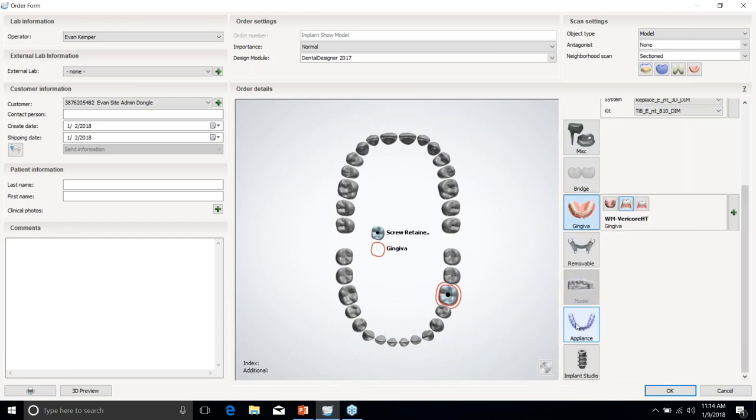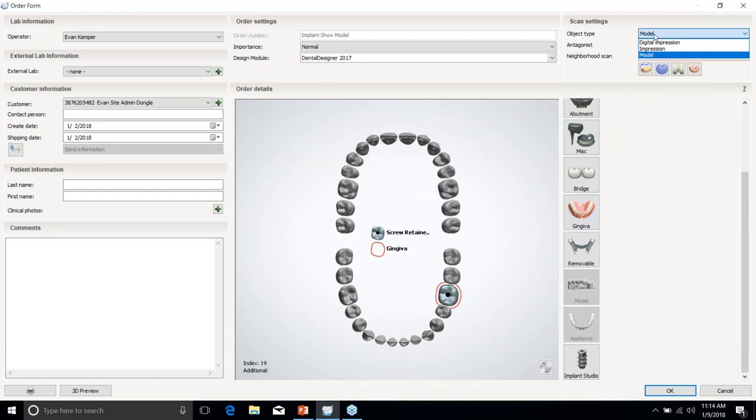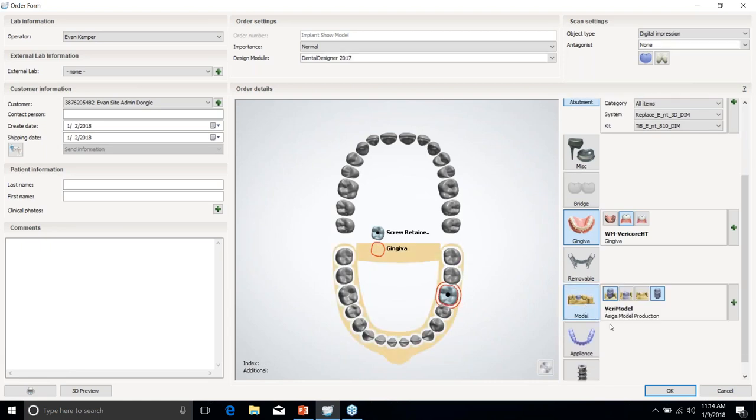And then lastly, if you are doing this on a digital impression, which this is from a Trios scan, then you can select to put a model on it. Depending on where you're going to have this printed and what printer it's on, and also what implant manufacturing kit you're using, some of them don't have a printed model analog, so it has to print your design as a die. But NT Trading does have printed model analogs, so I'll just go to an unsectioned model and pick our print material. So that's really all you have to do to set it up.